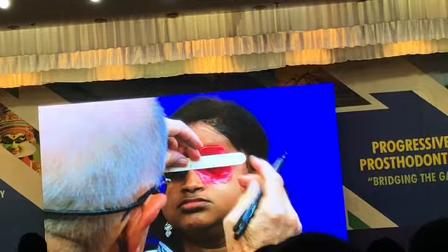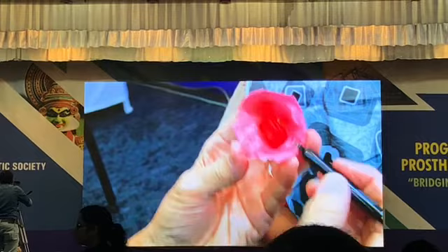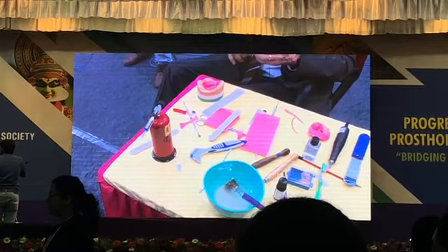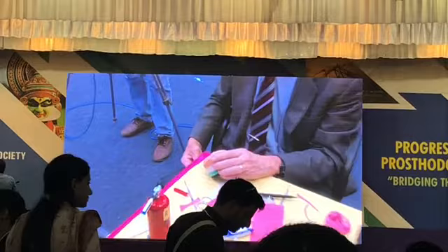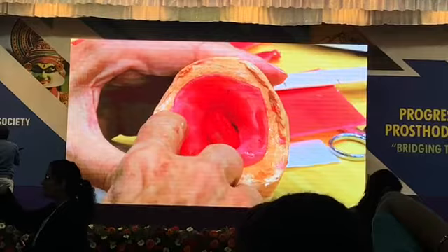Okay. And that gives me, if you want to look at this, here we've got a little mark here. See here. And a little mark there, and a little mark there, and a little mark there. Now, I have at least a guide to help me initially position the globe. Okay? So let's go over here. There we go. So this is the cast. This is the camera. There you go. So you can see this mark, and this mark, this mark. Let's soften up the wax a little bit.